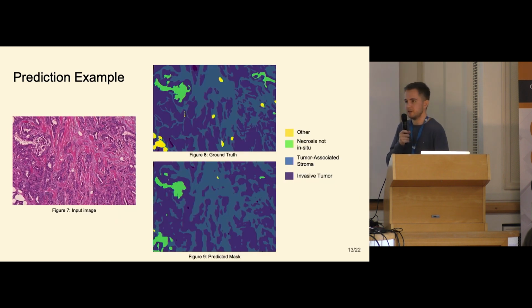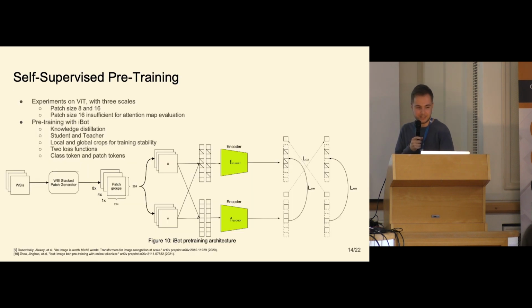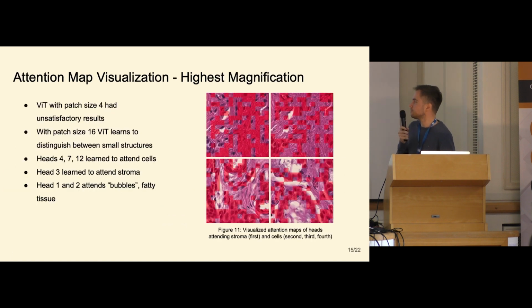With the third experiment, we trained or pre-trained with only a single scale, one scale at a time, and it is up for future work to maybe combine the pre-training process so that all scales would train at the same time. Our first experiments were pre-training ViT, or vision transformer, because it is much easier to visualize attentions. So we can visualize what the model focuses on, basically.